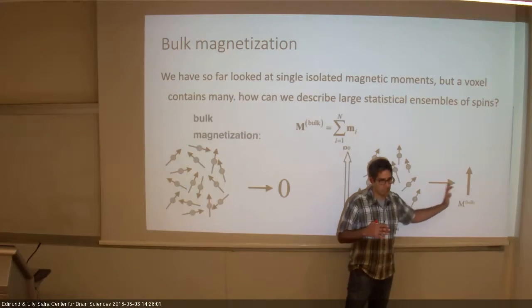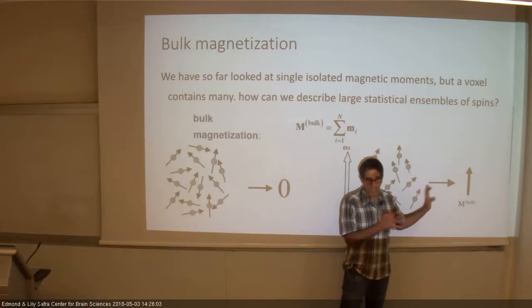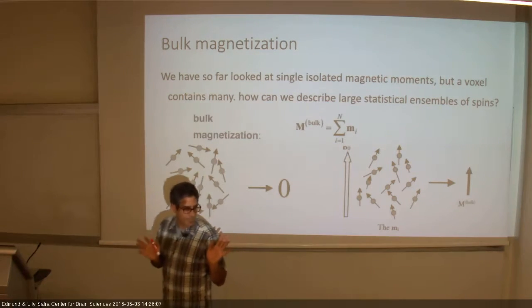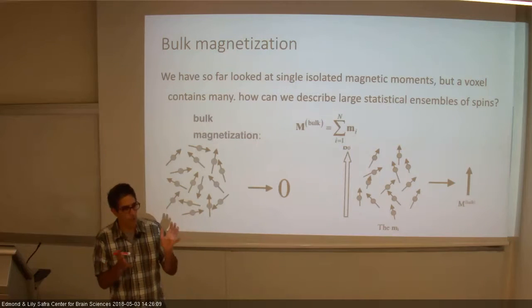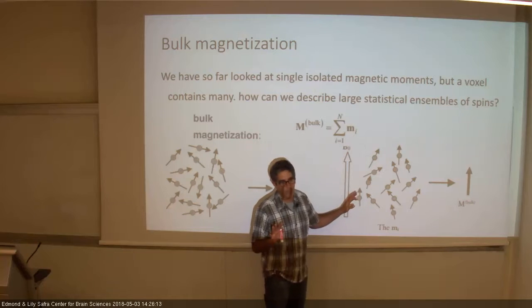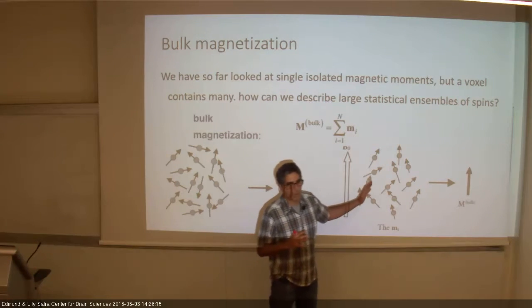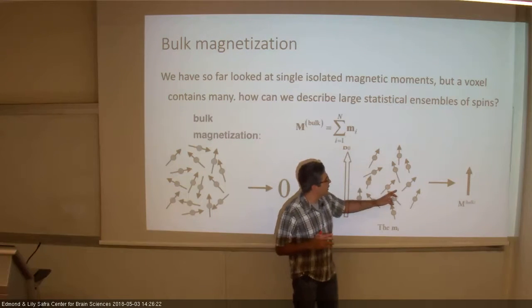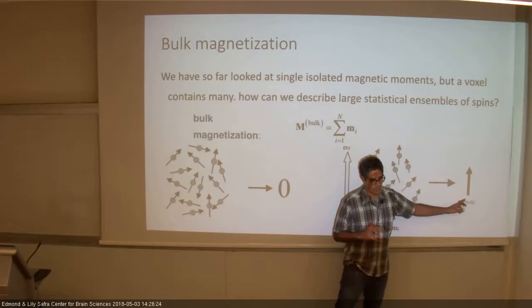So, everybody got it that we now have a magnetic vector? Just that for now. Okay, we sum them all. They all orient themselves. Not all is wrong here, but enough. There is a preference to be oriented to the B0 field in a way that actually generates a magnetic vector.